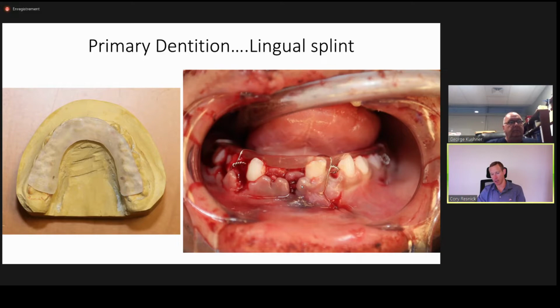Because most of the patients in whom this would be applicable may not be able to have traditional dental impressions or even a digital intraoral scan performed while awake. You might need to obtain the dental information necessary to create this splint during an anesthetic. And so then the question becomes, is there going to be a series of anesthetics necessary, one to get the dental information necessary to create the splint and then another one to place it, or do you have the ability to fabricate a splint very quickly using an in-house lab or your own printing techniques very quickly during that same anesthetic?